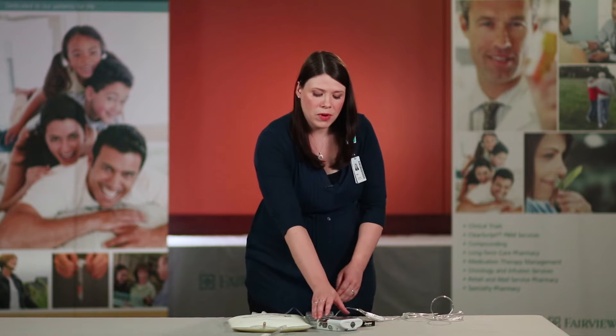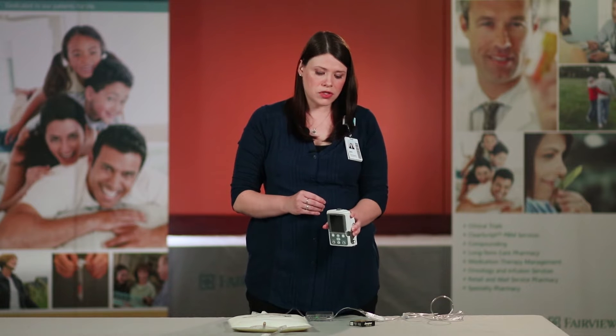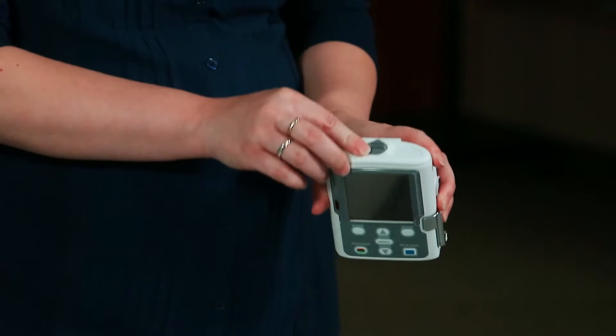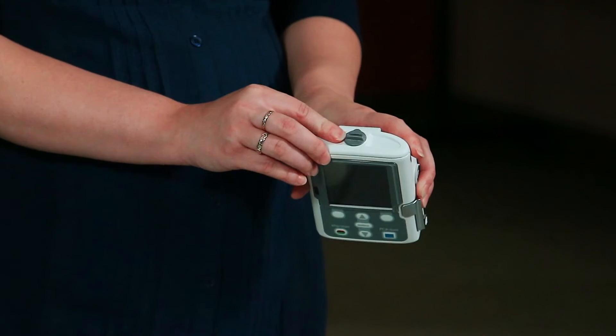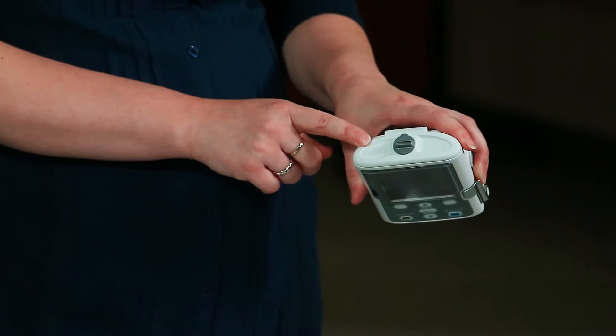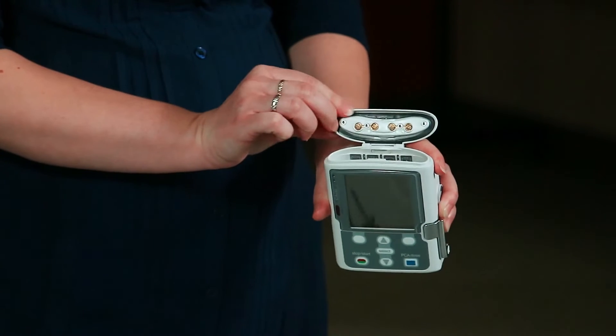The first thing we want to do is add the batteries to the CAD pump. These should be changed daily. To do this you can use your fingers, a coin, or the CAD key to turn the knob on the battery compartment, which is at the top of your pump, counterclockwise. It will then open.